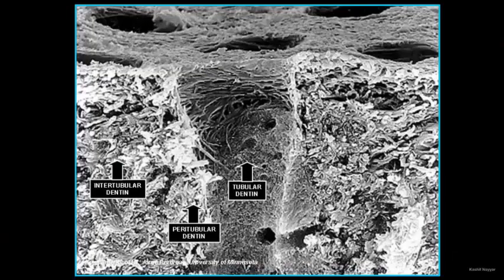Understanding this illustration here, you can appreciate that this is a dentin surface. You can see the dentinal tubule and the intertubular dentin and the peritubular dentin. And now consider this. When you apply the resin monomer or the dental resin, it is in the liquid phase, which can penetrate inside these tubules. And when you cure them, they become hard, they become solidified. There is a phase change. They become solid from the liquid phase after curing.